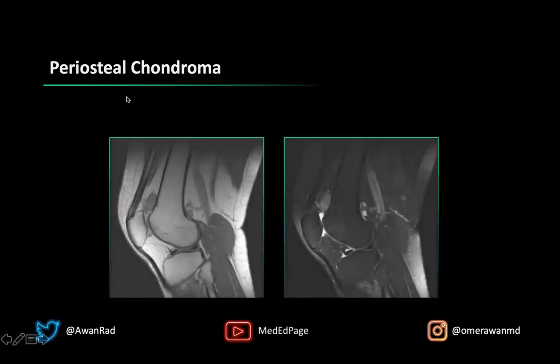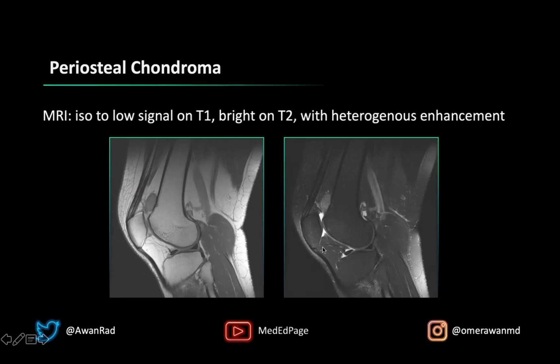Looking at the images again, the cortex is nice and thick and straight, but as we get to the lesion it becomes thin and saucerized, ill-defined, with an undulating contour — very visible on the T2. No surrounding bone marrow edema. On MRI, periosteal chondroma is typically iso-intense to low signal compared to muscle on T1 — in this case slightly brighter — and heterogeneously bright on T2, as chondroid tumors often are. There's often heterogeneous enhancement on post-contrast imaging.